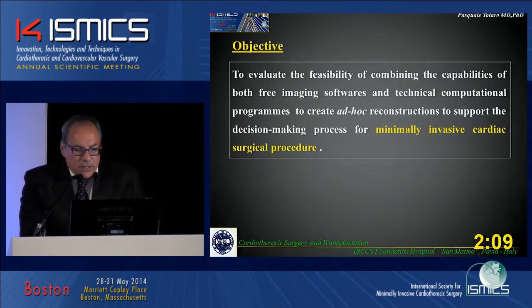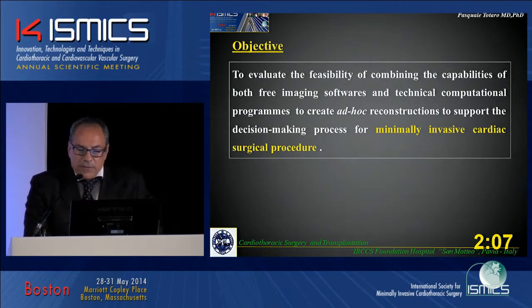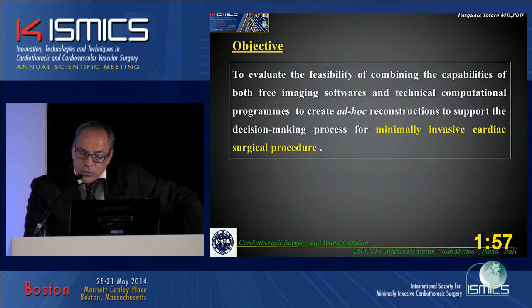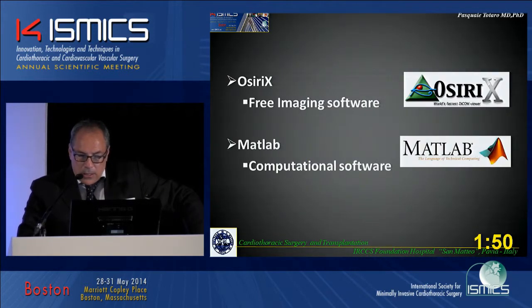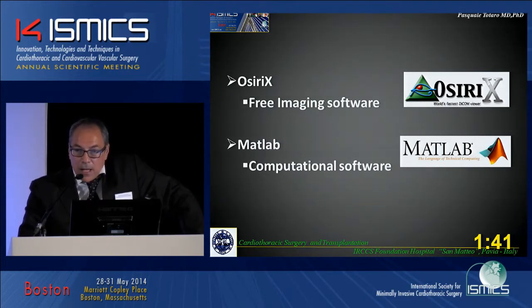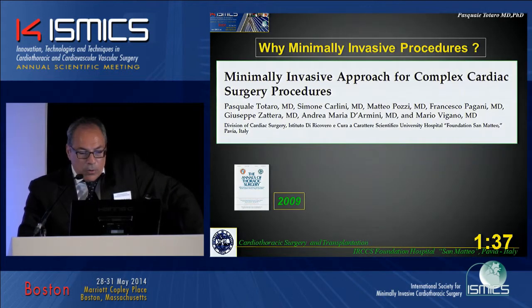The objective of this study was therefore to evaluate the feasibility of combining the capability of both free imaging software and technical computational programs to create ad hoc reconstruction to support the decision-making process for minimally invasive cardiac surgical procedures. These are the software we utilized: the free imaging software, Osirix, which is very well known, and the computational software, MATLAB, which was used by our engineering collaborator.